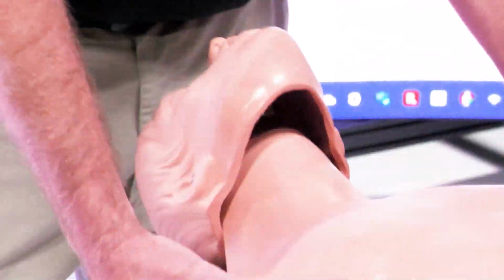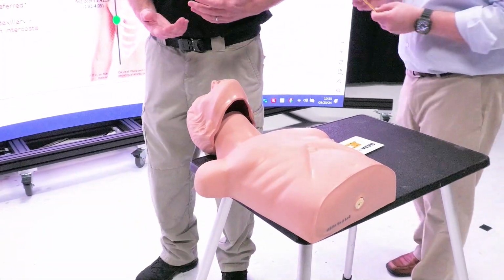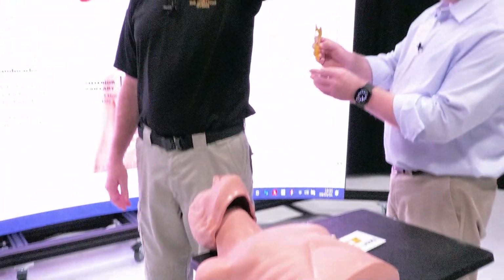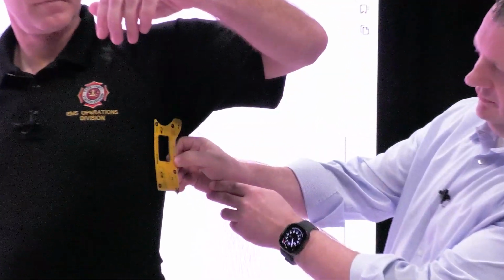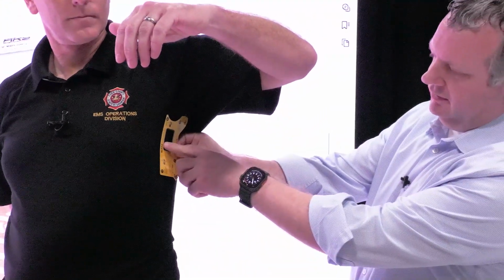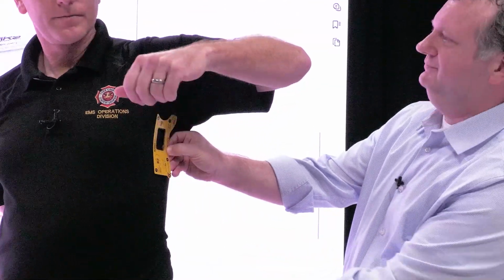And then, Doc, if you want to show them how simple it is with an actual person here. So basically you would take it, making sure that I can read it with the patient's back towards it. Place right there, and that gives you the place to go. It's very simple. And where's the hip? Hip is down there. Straight.